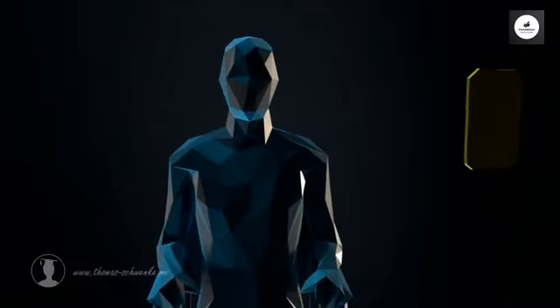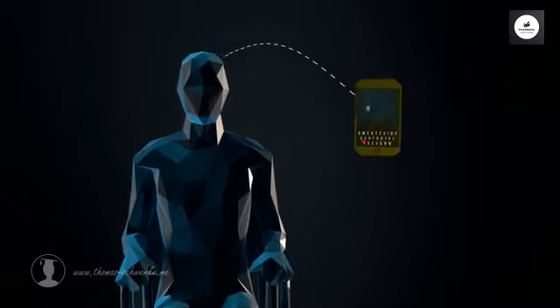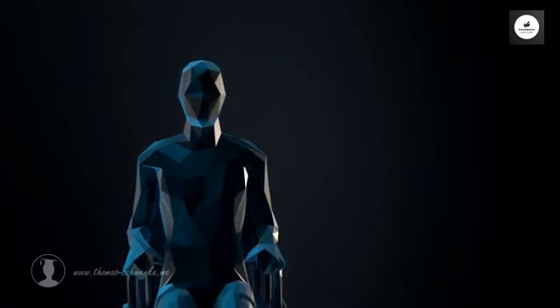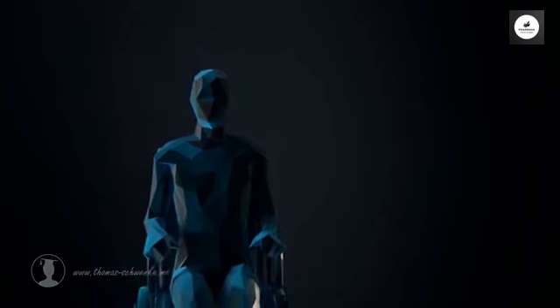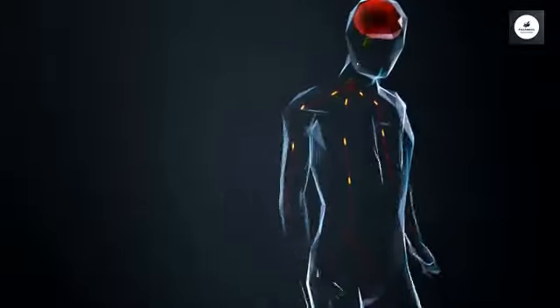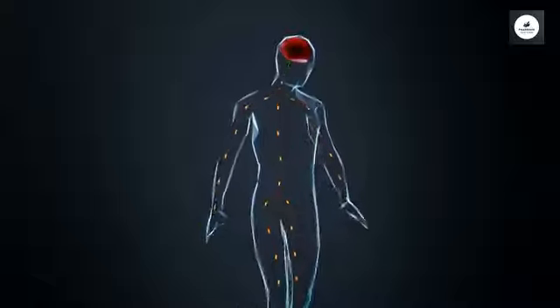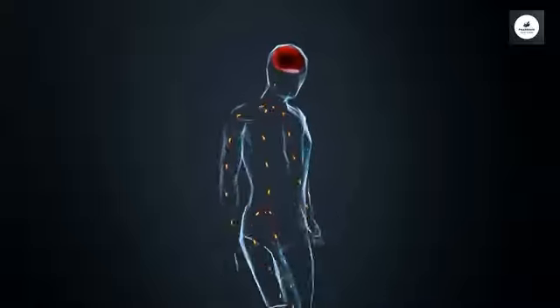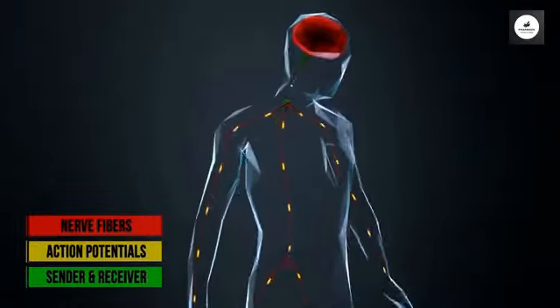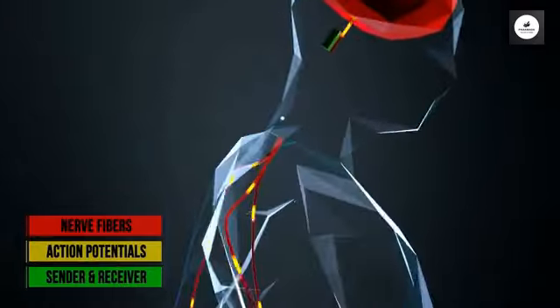With the help of the N1, it is possible to navigate a mouse pointer on a screen or control a smartphone. But in the near future, it should be possible to let people walk again. For people with paraplegia, such chips could help to bridge the nerve fibers destroyed in an accident. This would allow the brain's action potentials to reach the muscles.